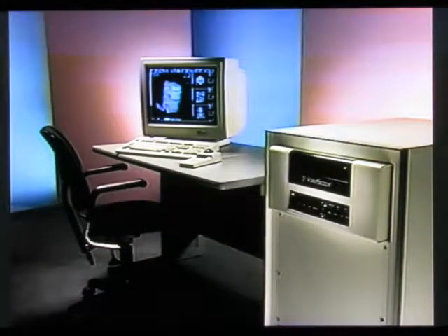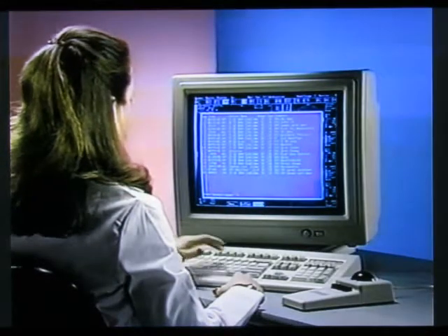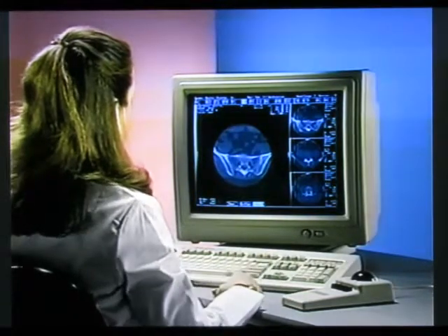on clinical case studies. This videotape presentation of case studies was filmed in real time as each case was reviewed and processed. Our first study is a 38-slice CT dataset of a 45-year-old male with lumbar spine pain. A user-friendly menu allows rapid selection of each case.